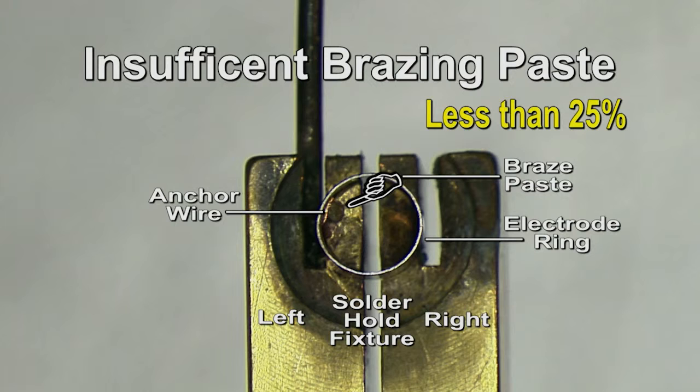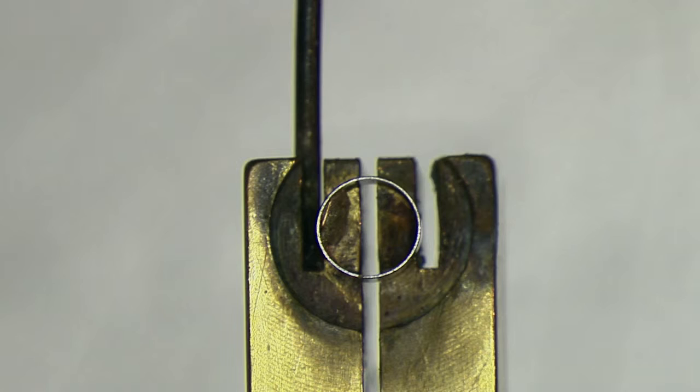To figure out what is just right, look at the left half of the ring holding fixture. If the paste covers less than 25% of the area, that is too little, or insufficient. Scrap the ring.